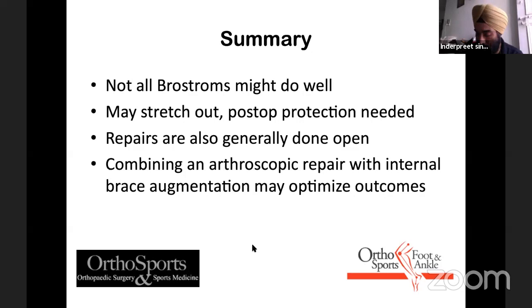And the first question is, like Satish said, he would actually put the ankle in dorsiflexion and slightly eversion, and then fix the ATFL. But what is the position of the foot? Would you do fixation on the fibular side? And then when you fix on the talar side, would you change the position of the foot?